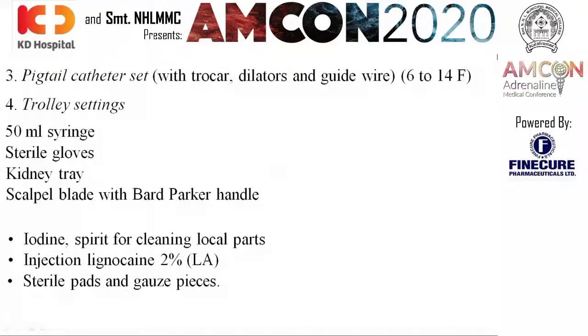Pigtail catheter set with trocar, dilator, and guide wire. Trolley setting in which 50 ml syringe, sterile gloves, kidney tray, scalpel blade, and local anesthetic like lignocaine, and sterile pads and gauze pieces.